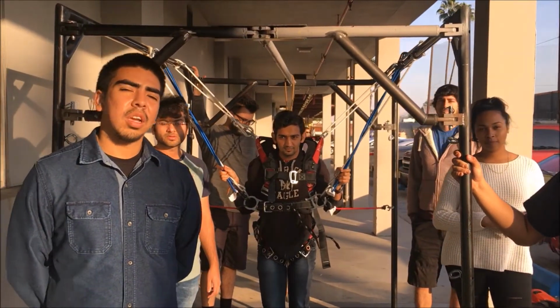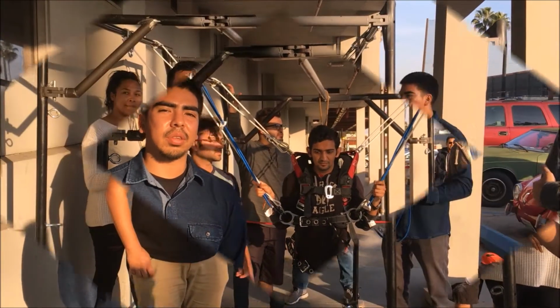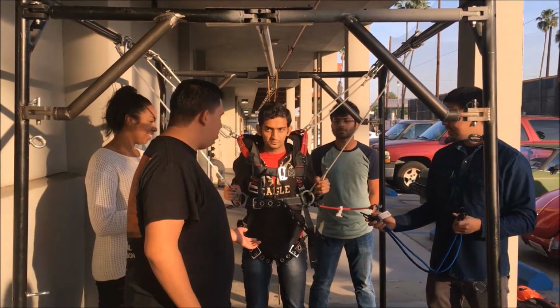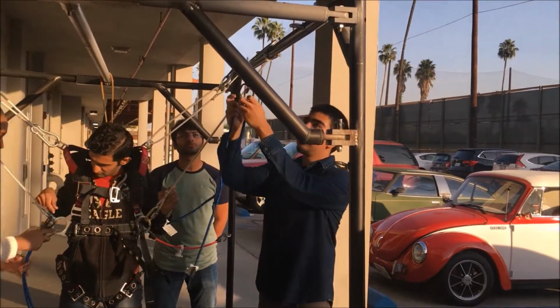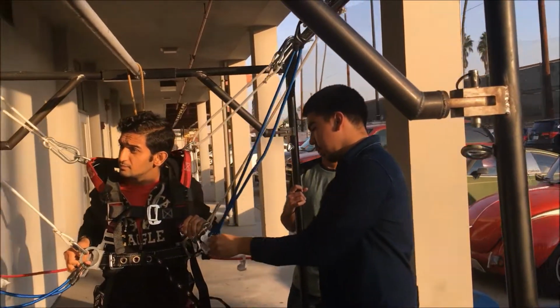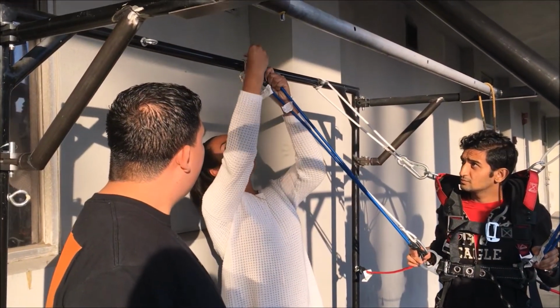Tool used for patients who have suffered stroke, spinal cord injuries, and traumatic brain injuries. Alright, so a main part of the spider cage is to add resistance to the patient's knees to be able to help them with the stability. Like this, the patient will be able to feel safe and not collapse.